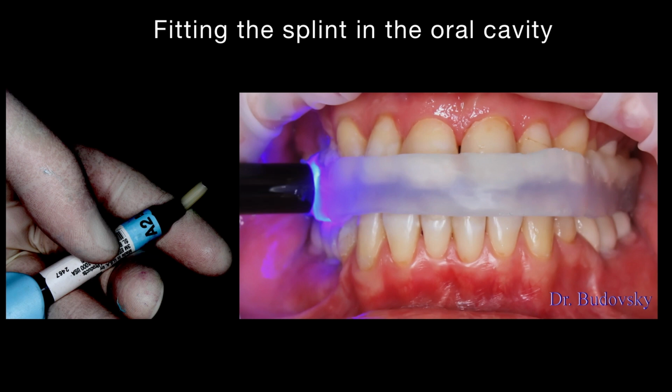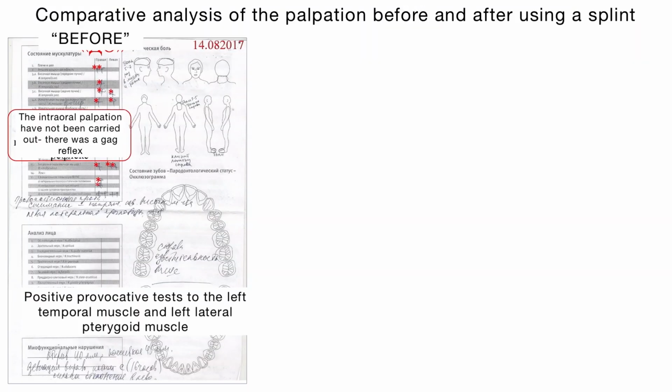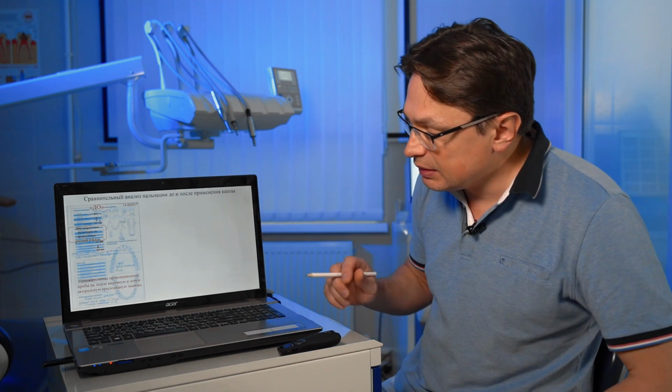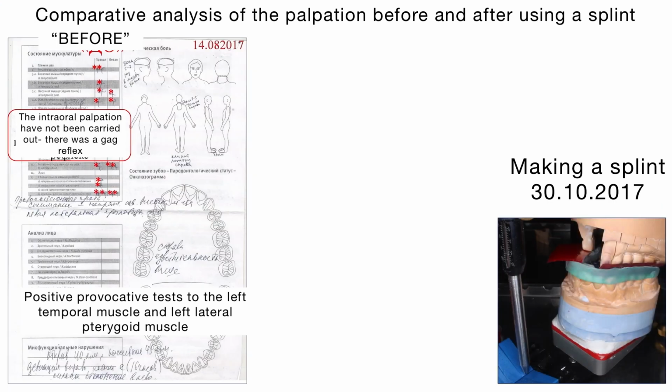And pay attention, as you remember, we provided an extensive diagnostics at the initial stage. It was of crucial importance, once again a crucial importance to observe all records and document. I don't consider myself a pedant, but this kind of work forces me to be, because further you may need to look back, but there will be nowhere to look. If you've documented all the data, you understand that the patient had pain syndromes, restrictions, deviations or deflections, hypertonicity, and after making and modeling a mouth guard, within 2 weeks you may see the situation change radically.